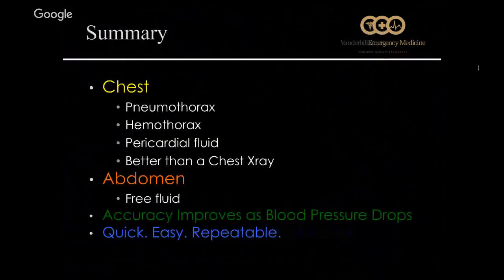So next slide, just a real quick review of what we covered. I know I threw a lot at you, but the nice thing about this is this lecture is recorded, so if you want to re-watch it just to help reinforce the ideas, it's all in there for you. So remember, in the chest, we're trying to answer a few clinical questions. Is there a pneumothorax? Is there lung sliding? Moving all along the anterior chest, and I'll also look along the lateral chest for that lung sliding to see if there is a pneumothorax.